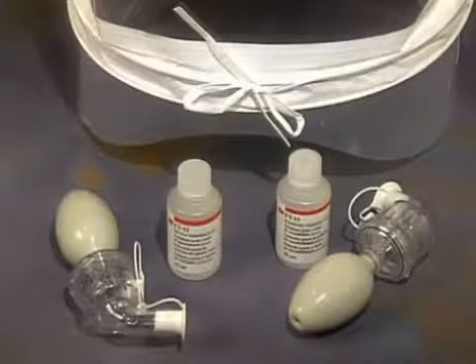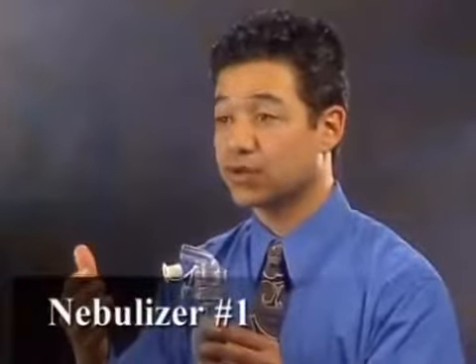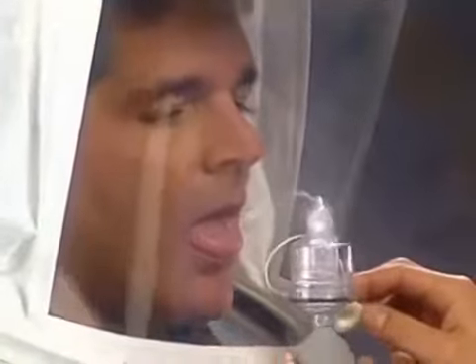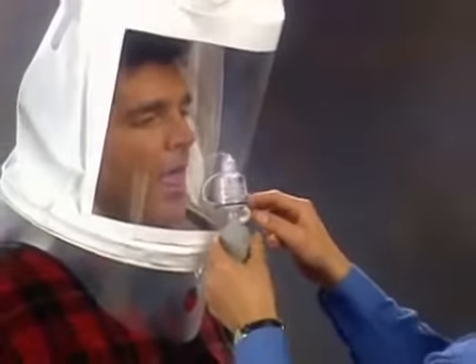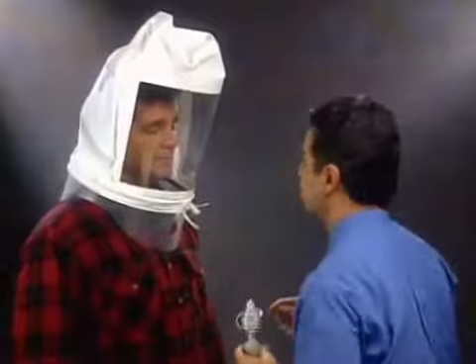The first step is a sensitivity check. It establishes your ability to taste the test agent. You don't wear your respirator for this step. Your instructor will place a hood over your head, positioned so that there is about 6 inches between your face and the hood window. This allows free movement of your head. Using nebulizer number 1 containing the sensitivity test agent, the instructor will initially spray 10 squeezes rapidly into the hood through the hole in the window. You must breathe with your mouth open and your tongue slightly extended.